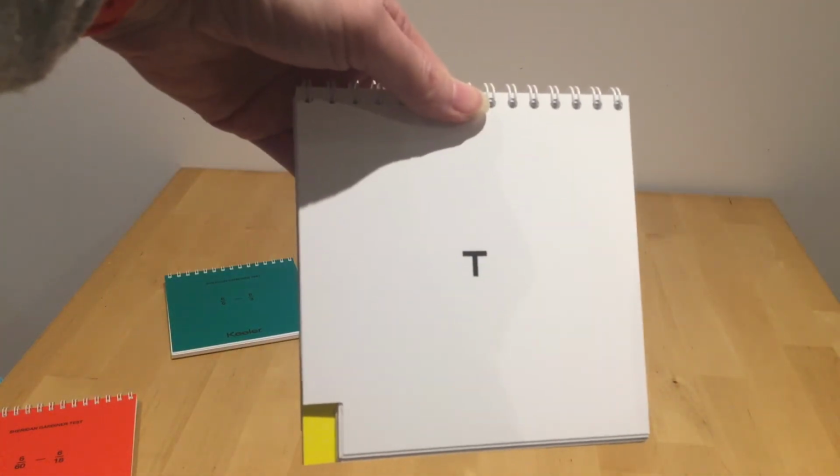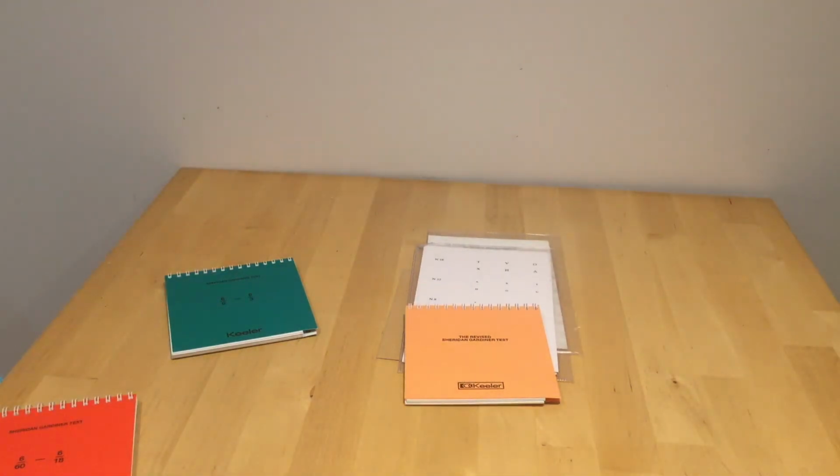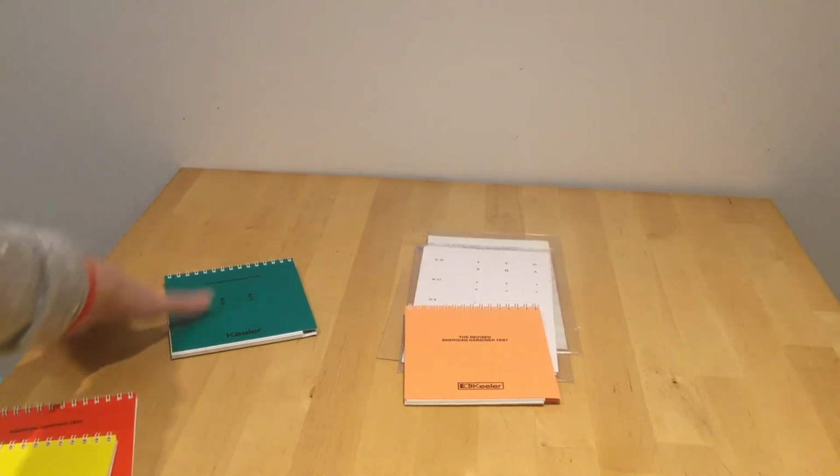There we are. Now remember, if you're doing this at 6 metres and they can read all the letters at value 6, then they have perfect vision. But you can go further with the green book, 6/6 to 6/3. So a few more. There's 5 in here as well, and so on.